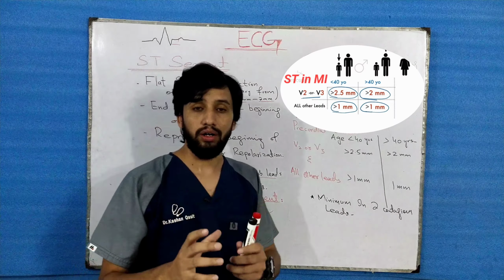So this E stands for electrolyte imbalance, for example an increase in potassium level like hyperkalemia. So this is the first condition here. E shows the electrolyte imbalance, and L is for left bundle branch block. Here comes the third letter: E is for early repolarization, which is a benign condition, benign early repolarization. Then comes the ventricular aneurysm.